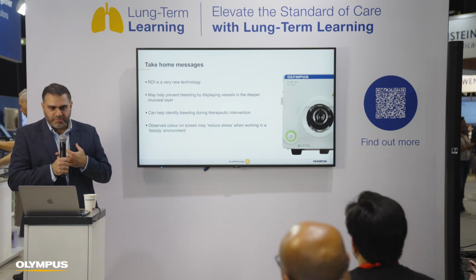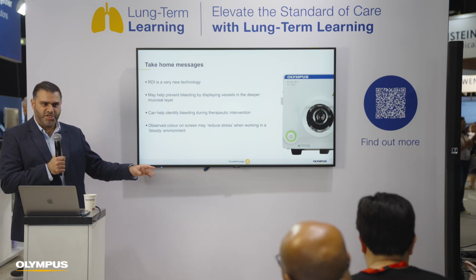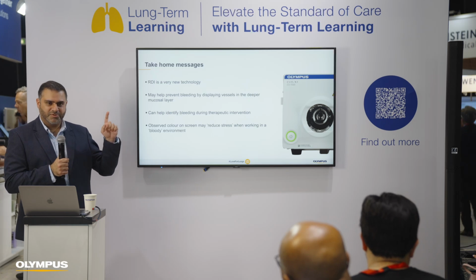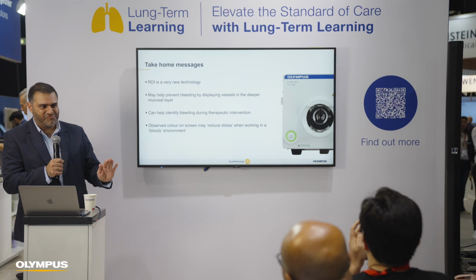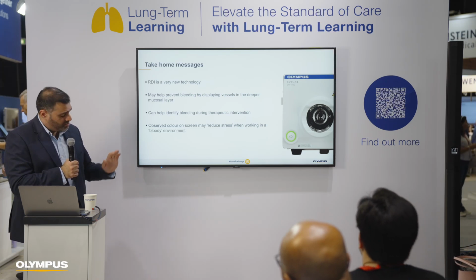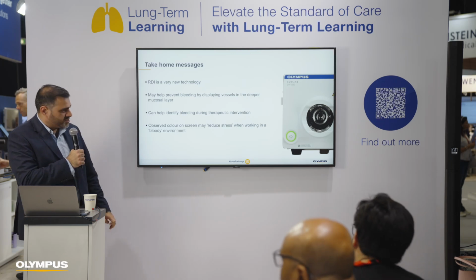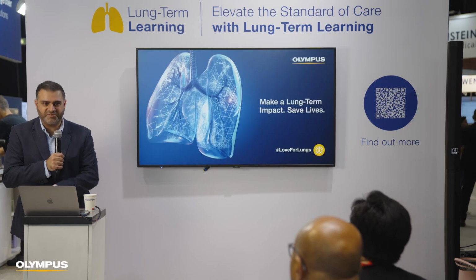Now, this is completely anecdotal and personal to me, but actually for me, it reduces my stress levels seeing a screen that's a little bit yellow and amber compared to seeing a screen that's completely red and full of blood. So, for me, it reduces my stress when we're doing these sort of procedures. And that's everything I have to say about RDI.